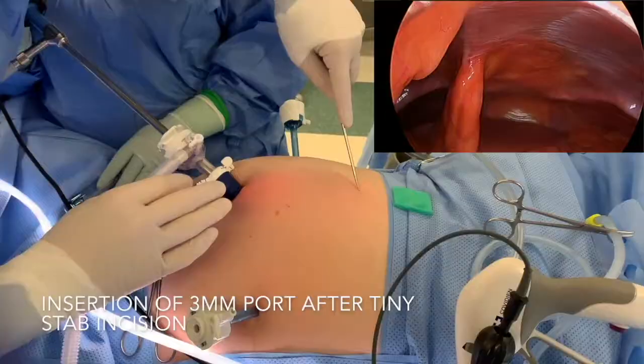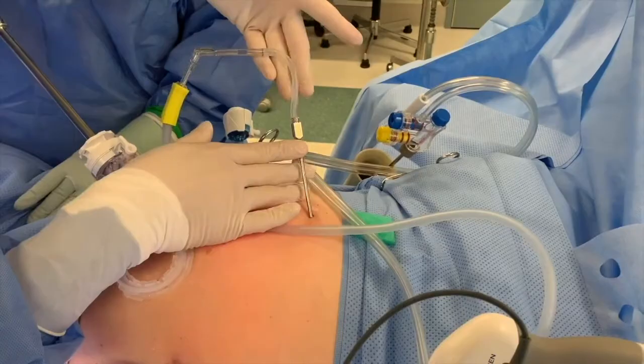Example 2: Carl Stort's Cavallo port. This is a reusable valveless mini laparoscopic port with an external lure lock connection that fits the Livac tubing.